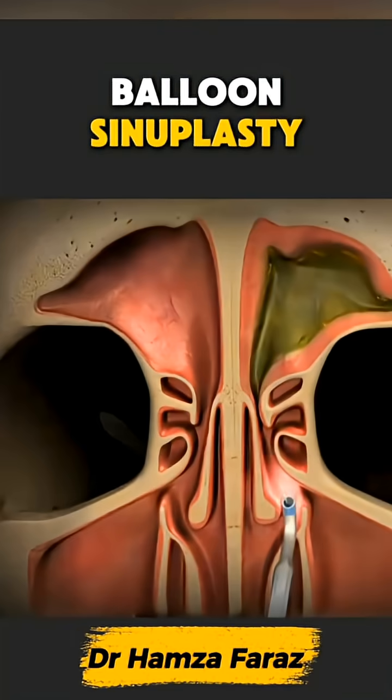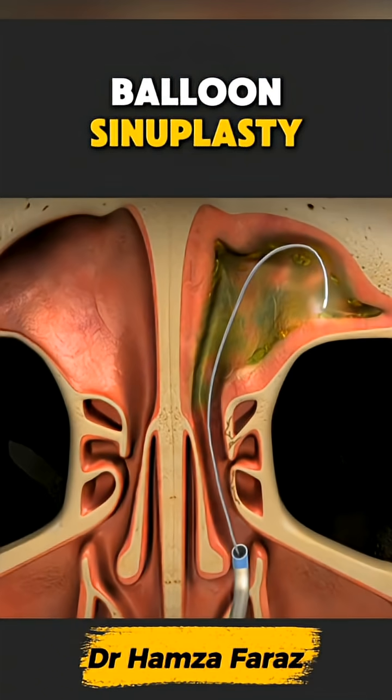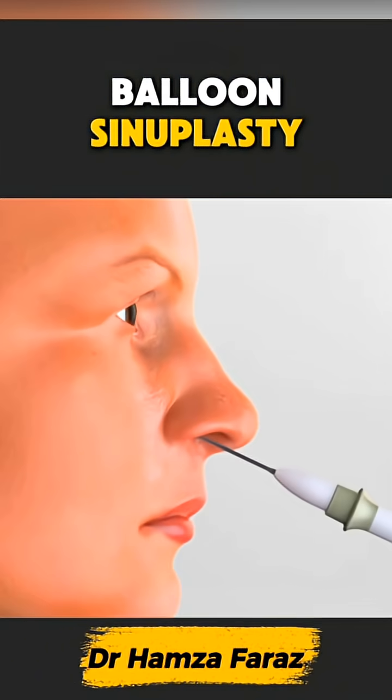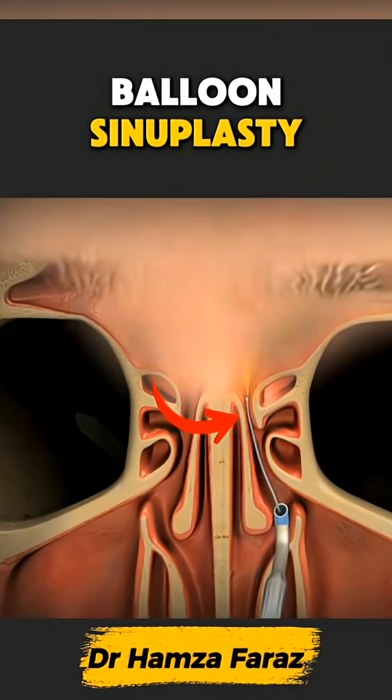Balloon sinuplasty is a minimally invasive procedure that helps open blocked sinus passages and restore easy breathing. It starts when the doctor gently guides a thin, flexible wire into the clogged sinus opening.